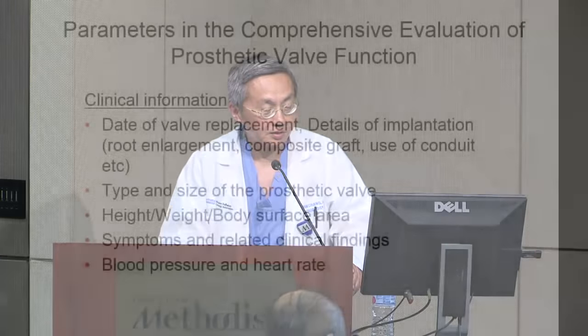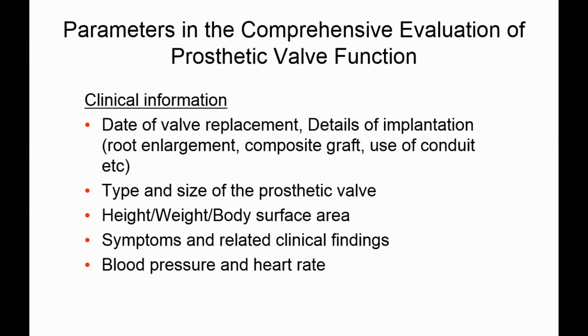Okay, so this is one of the most important slides, I think. Whenever we evaluate a patient with a prosthetic valve with imaging, the most important information we try to get, this is also for the sonographer and the fellows, is when the valve is placed, if it's possible, as much information as we can about the details and circumstances.